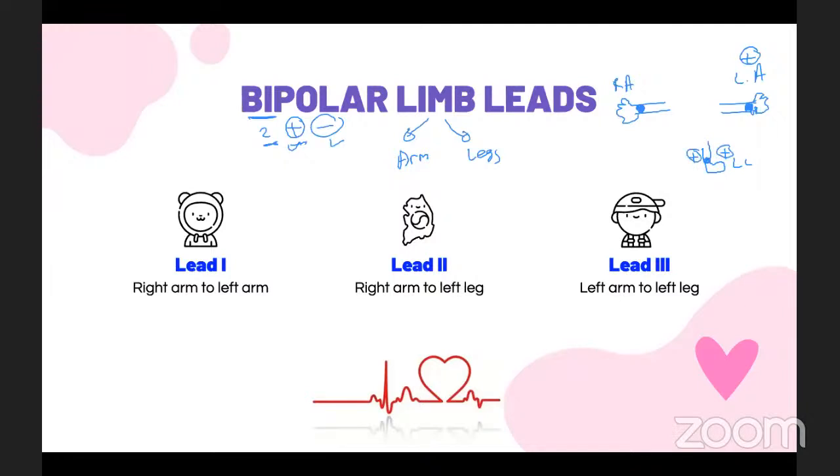But then there's always an exception to every rule, okay? There's an exception to this rule, but I'll just tell you what the rule is. Positive electrodes on the left side. The right arm, there's no heart, so we add negative. We'll add 2 negative charges. I won't tell you the exception just yet. Let's tell you the leads first.